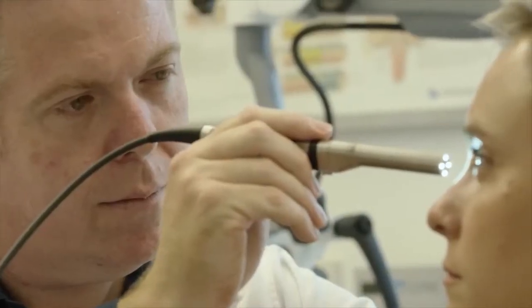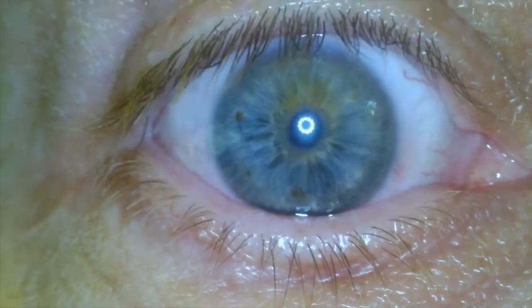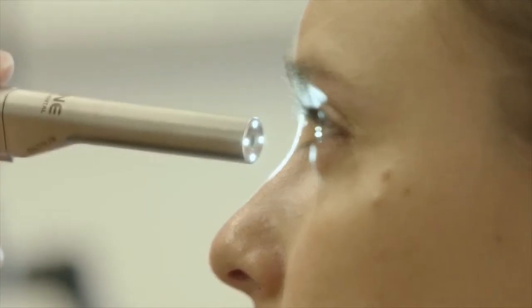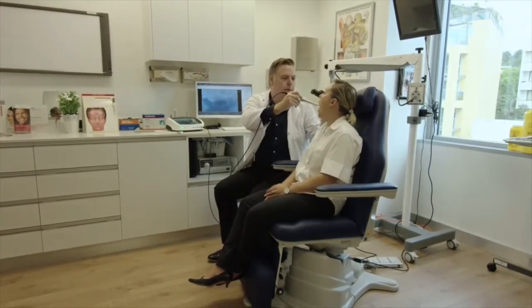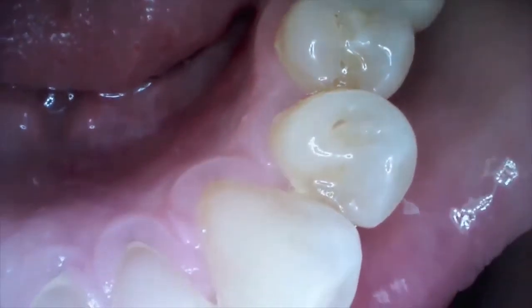The general exam probe can also be used for examinations of the eye and is ideal for monitoring cornea growth or removal of debris from the surface of the eye. Images and videos are available to remote specialists through the integrated WebRTC video conferencing protocol.